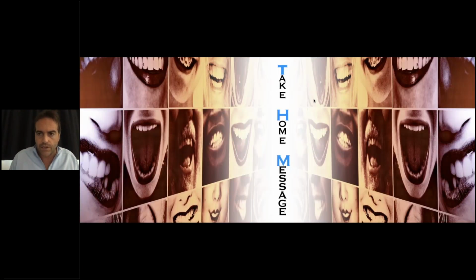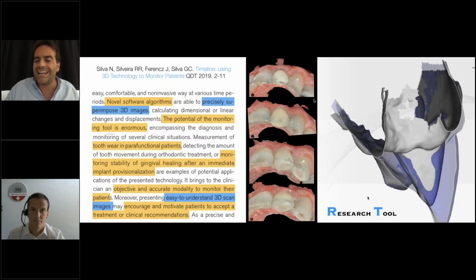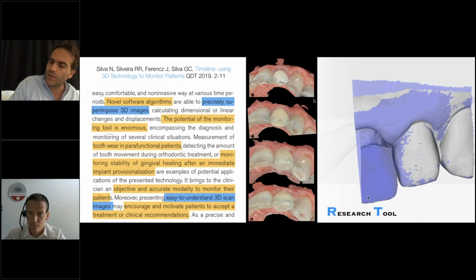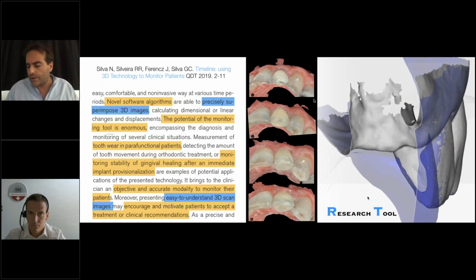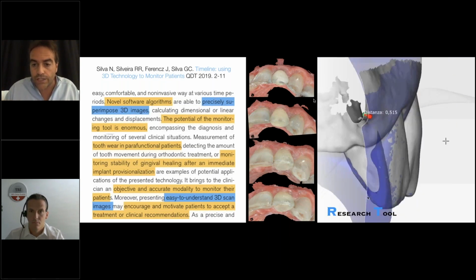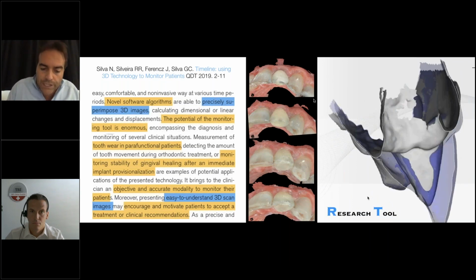daily routine. So, the take home message, I'm perfectly on time. Which are the take home messages? Think about digital dentistry like an everyday tool. We have started from a night guard. We moved forward with a single crown in the posterior area, single crowns in the anterior areas, smile makeovers on natural dentitions. We are implementing it more and more on full arches.